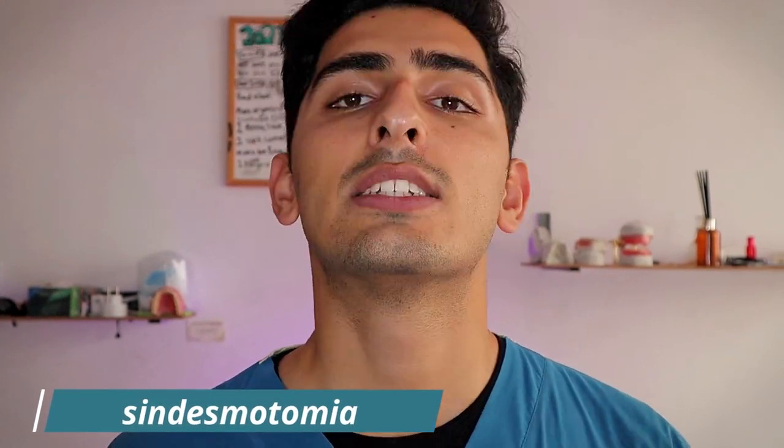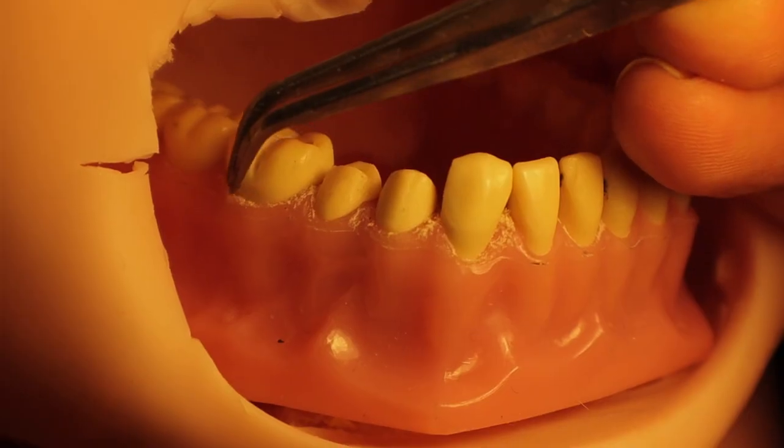Once the patient can't feel anything, it's time for the first step of extraction: syndesmotomia. This is the process of separating the tooth from the periodontal ligaments and the gingiva, making the tooth a little bit looser. Since the tooth only had grade one mobility, we needed to carry out syndesmotomia. I grabbed my forceps, closed them together, and went all around the tooth in a strong motion going apically and then across. You'll actually feel the periodontal ligaments tearing — that's when you know you're doing it correctly. Then we used a gauze to clear the blood for better visibility.